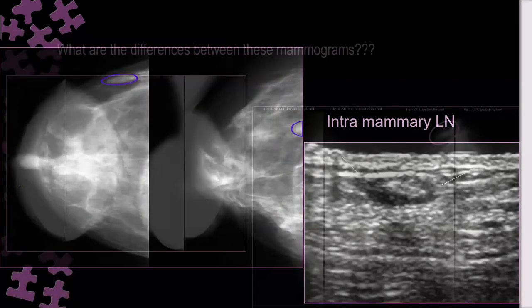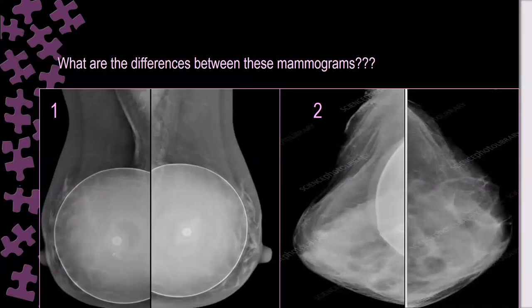If we go back, Sumaya said here the same name, Eklund. This is the same. But because they are pushing the implant inside and pulling the parenchyma, it will not appear as the usual regular breast without implant. This is the MLO of this mammogram. Here, this is the visualized part of the parenchyma. This is part of the implant pushed here, and the other one is not visualized. This is the implant displaced view.